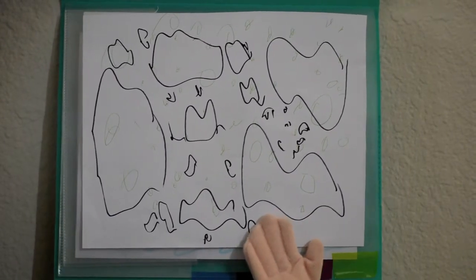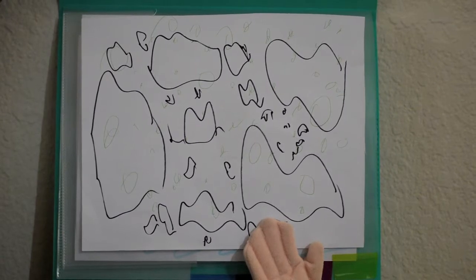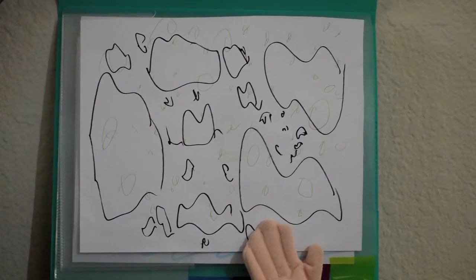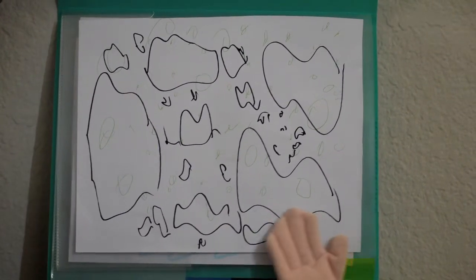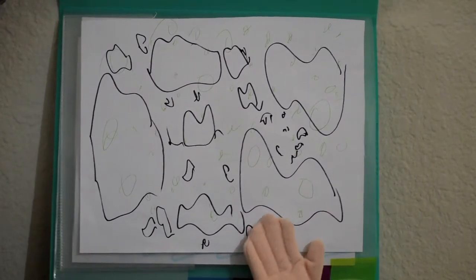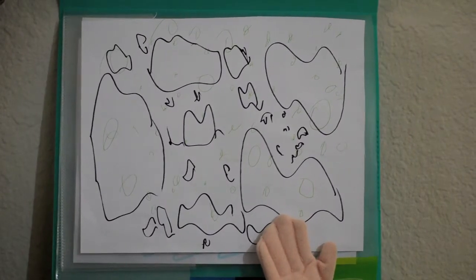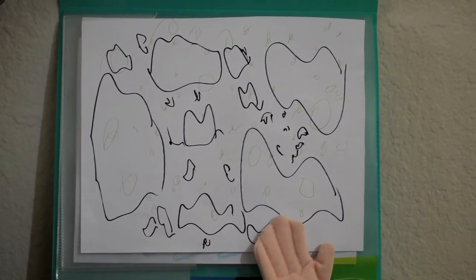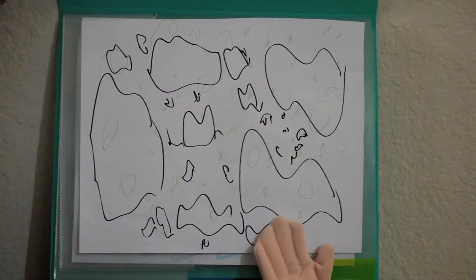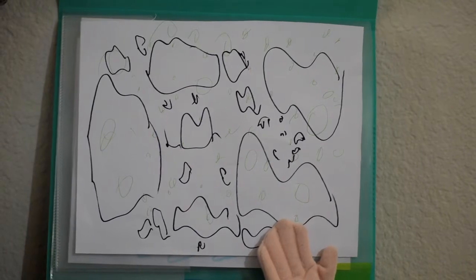There are different types of films, but since screen film is what is most commonly used in diagnostic imaging, it is what we'll be focusing on today. The varying size crystals you see in the emulsion layer allow for more shades of gray. This is called contrast. Another aspect of using film is the speed. Double emulsion is faster, a thicker emulsion is faster, and larger size crystals are faster. All this helps reduce patient exposure.